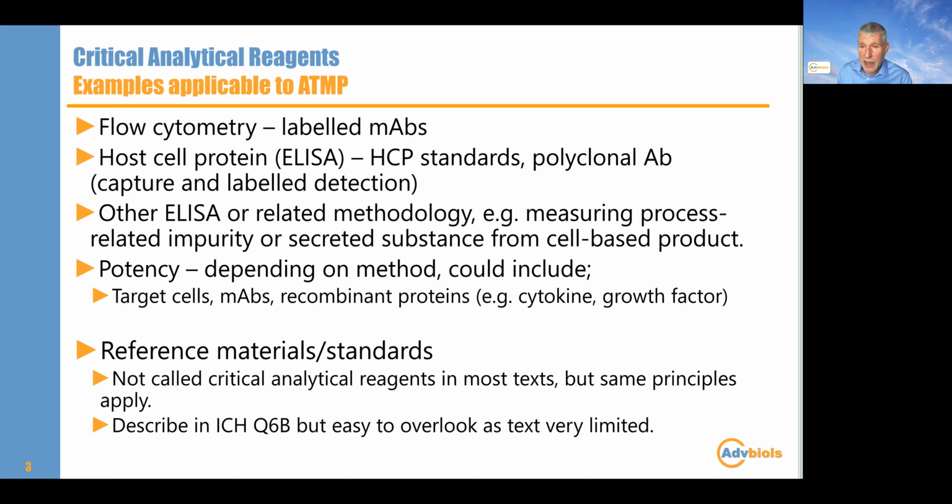But for other products, and generally this is done for biotech, they would make a specific assay that's specific to the process. And so you would take some host cell protein, some impurities from your process, and immunize rabbits or goats and create polyclonal antisera, which you then use to make an ELISA. You might label some of those with horseradish peroxidase or something similar, or a chemiluminescent substance or something, and create an ELISA. Now, just because you bought that ELISA off the shelf from a supplier, it doesn't exclude you from the requirements of dealing with these as critical reagents. It's just that you're now going to have to work with your supplier to deal with that.